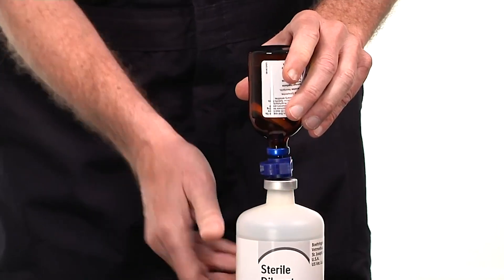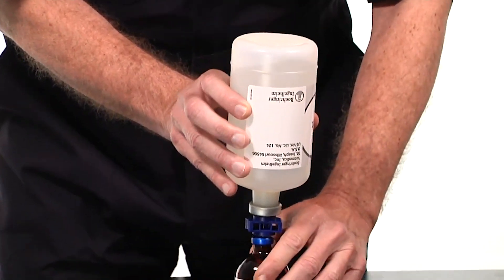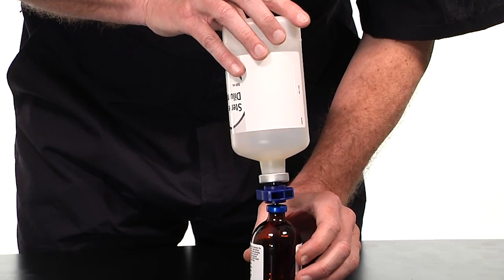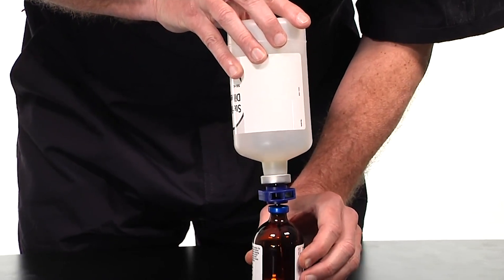While the vials are still connected by the transfer spike, rotate the sterile diluent bottle and Ingelvac PERS so that the sterile diluent is on top. Transfer a portion of the sterile diluent into the Ingelvac PERS bottle. The amount transferred needs to be enough to rehydrate the Ingelvac PERS product.